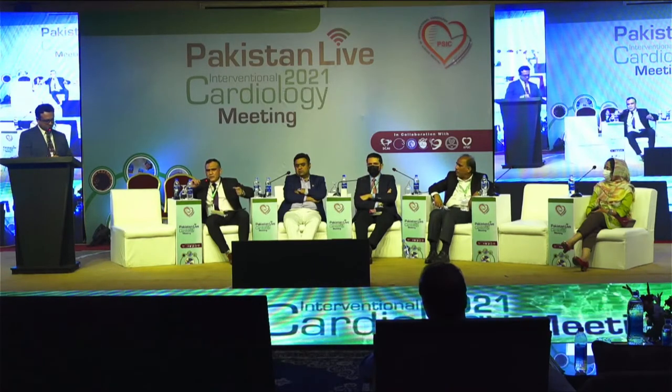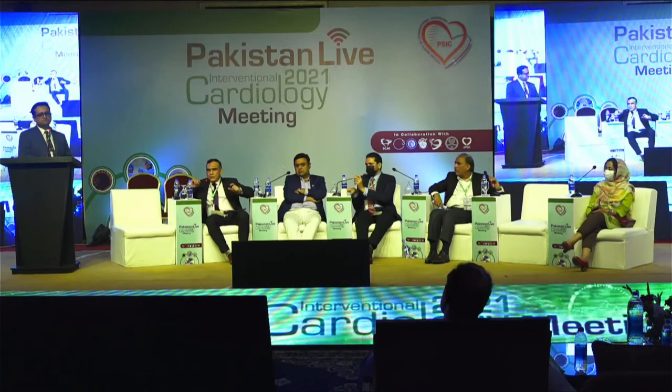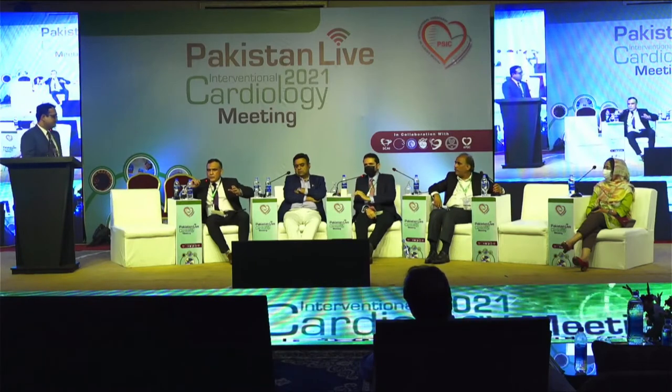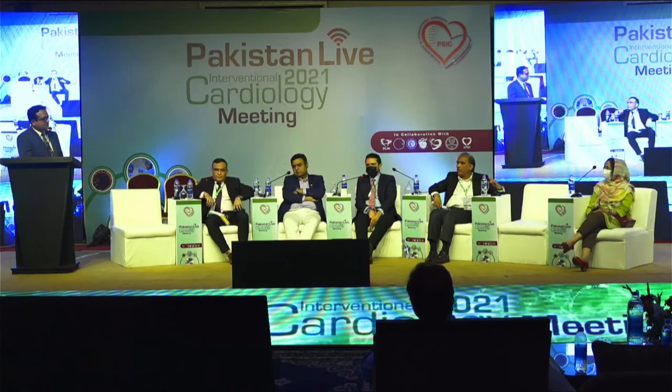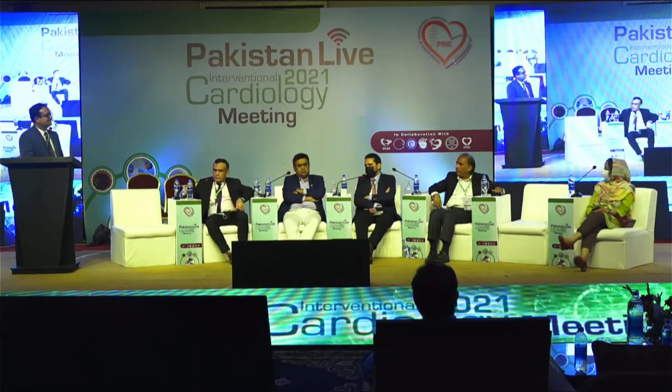So I think just for that purpose, an extra cost of 70,000-80,000 rupees, probably in the Pakistani perspective, is not worth it with experienced operators, the ones who've used IVUS and have got used to it, and now know what the stent should look like geographically once they've deployed it and use the correct size. Thank you. Professor Nasi?